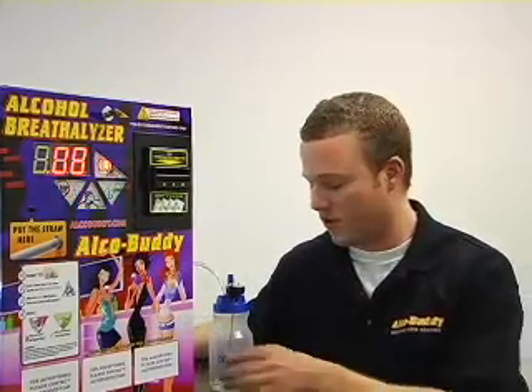Once you've created the solution and thoroughly mixed it, the next step is to fill the AlcoBuddy calibrator, which we provide to you, halfway.